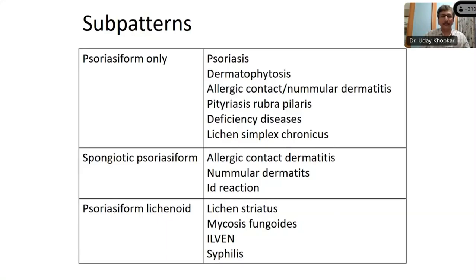So that's a common site for plaque type of psoriasis. Stable plaque type of psoriasis gives this classical appearance. The other variants of psoriasis may not be as classical, as already told to you by Dr. Raj Lakshmi. Yeah, thank you.